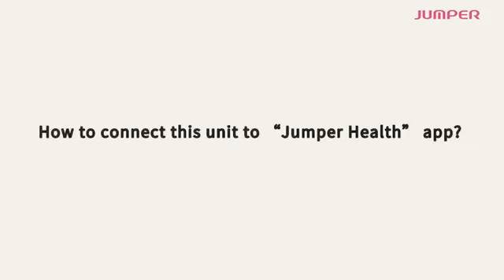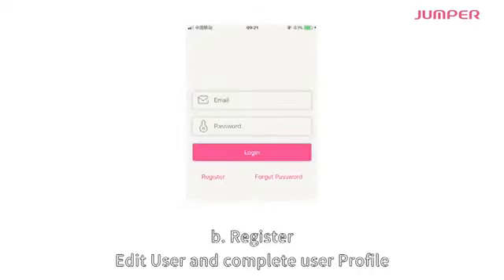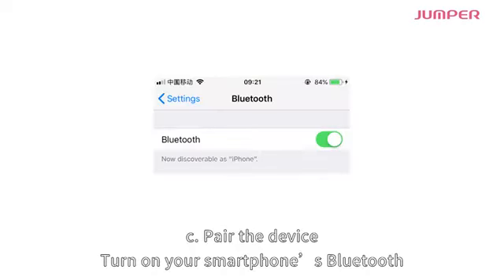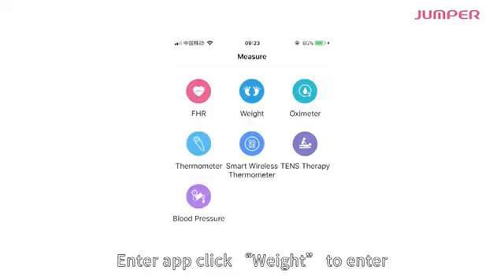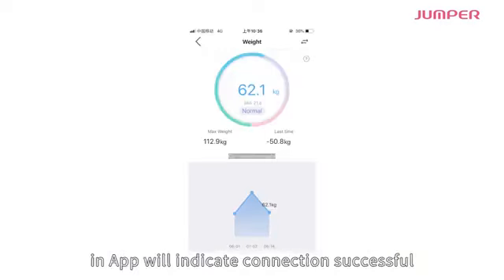To connect this unit to the Jumper Health app: download Jumper Health from the iPhone App Store or Android Google Play and install it. Register, edit your user profile, then pair the device — turn on your smartphone's Bluetooth, open the app, click the double arrow to search for the device Bluetooth name, and connect.